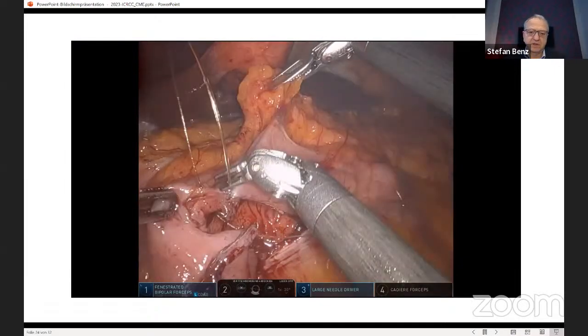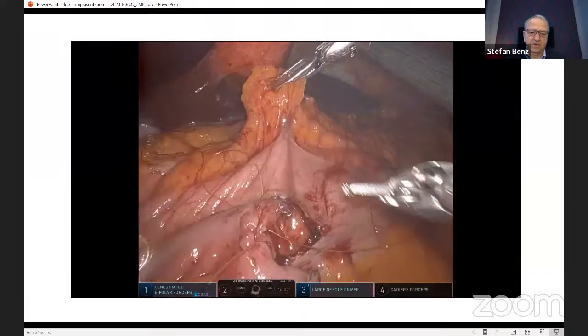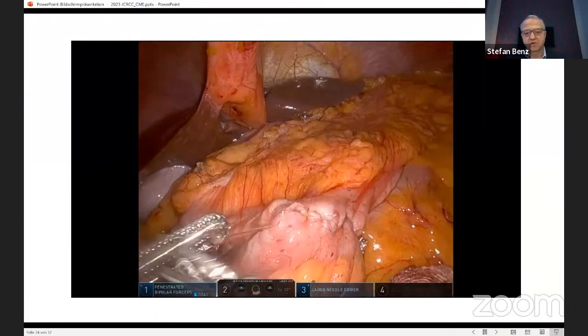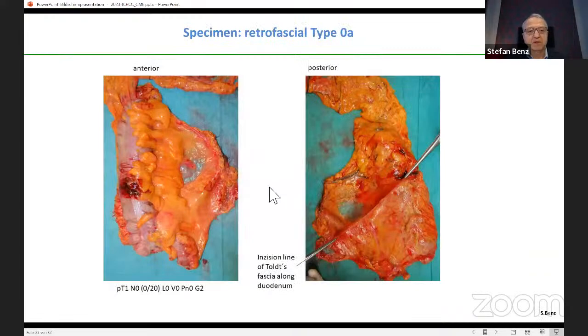I think this is okay. You just see the end of the suture and how it looks. That's the specimen. You see, it's complete, and so you have the surgical trunk. You have the window, which is surrounded.